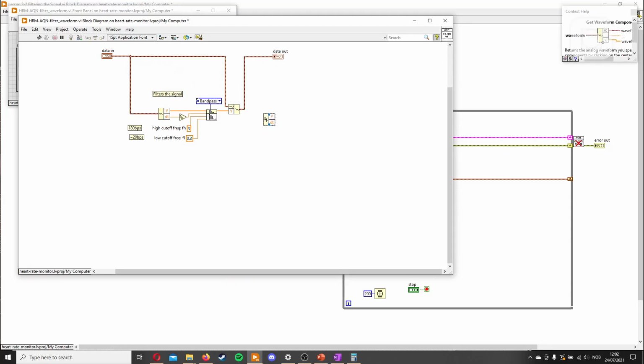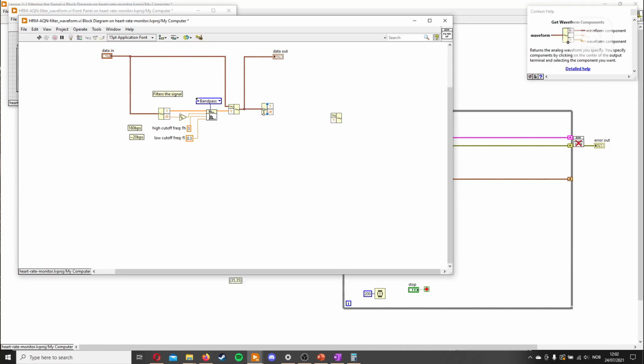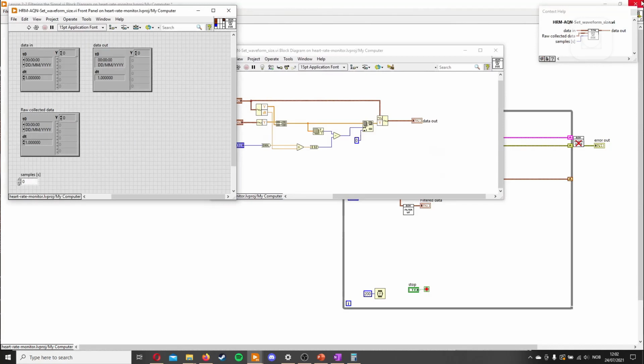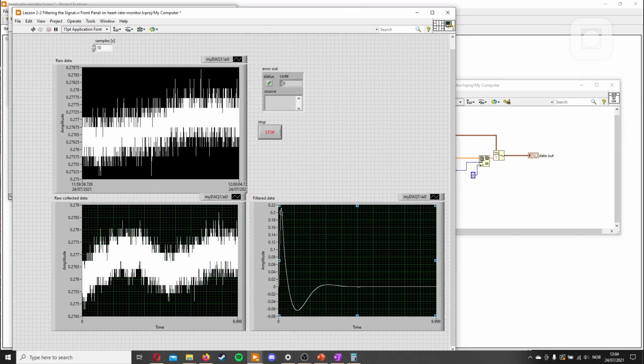So we'll need this one and this one again because we want to unbundle it and then remove parts of the data. And here, this function is very similar to the function we have here. So we can actually compare these two. So what we did here, we removed the end of the signal, like the oldest signal is what we removed here. And that's also what we want to do here because this loop is the first part of the signal that comes in. And what would be perfect is to remove it around here.